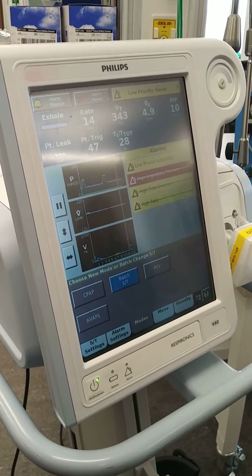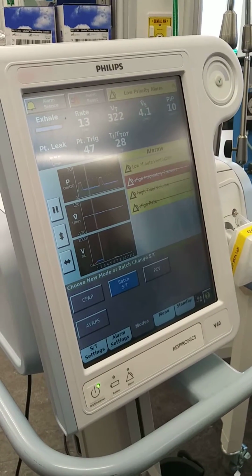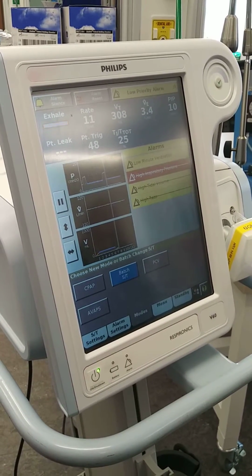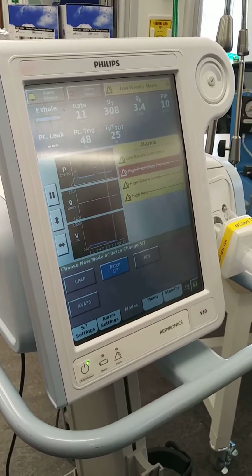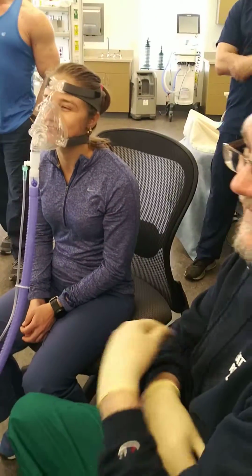Low minute ventilation. So your tidal volumes have dropped off to basically just the mask, and it's not going to breathe for you. But it's trying. Breathe. I'll save the patient.